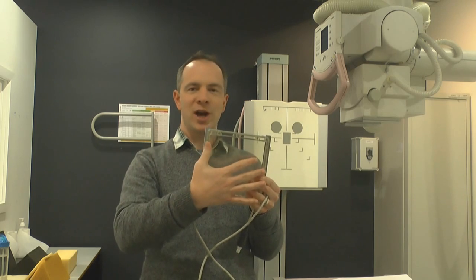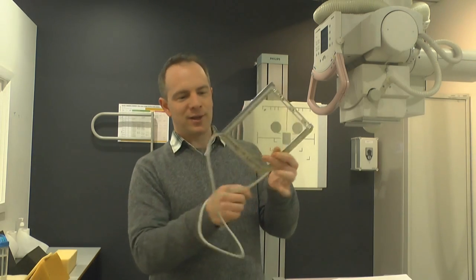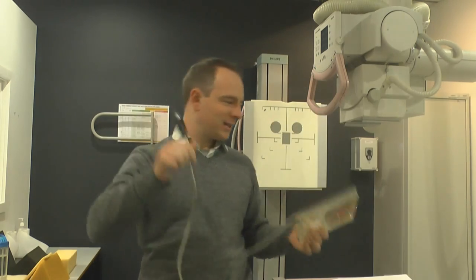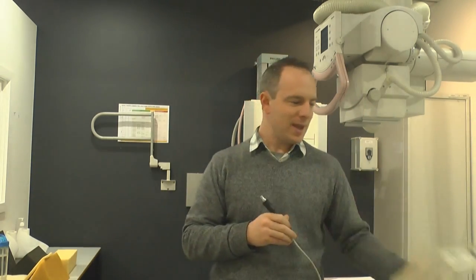And so now we have charge flowing through the ion chamber. That charge can flow through the circuit into our meter when that is connected, and we can measure a current. So we're basically measuring ionizing effect as a current, and that in turn can be converted to a dose.